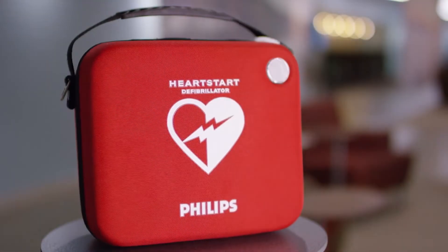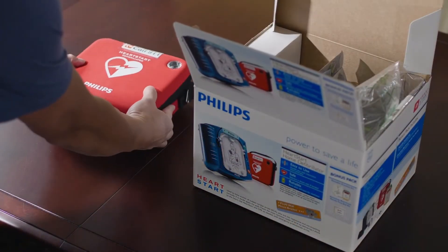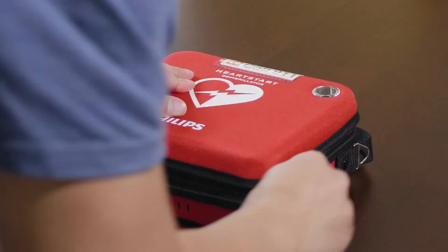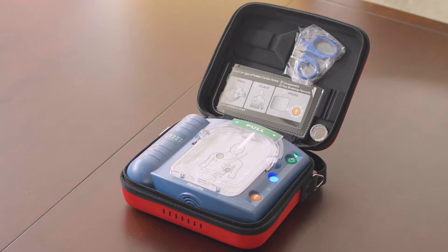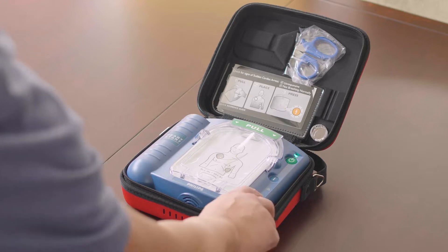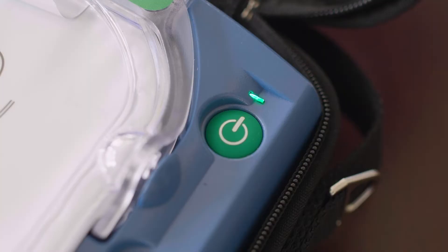To set up the HeartStart Home AED for the first time, first remove it from its packaging, then take it out of the red case and pull out the red tab to start the automatic battery self-test. A voice from the HeartStart Home AED will instruct you to press the flashing orange shock button — no shock will be given during the self-test. After about a minute, the test will conclude, the device will turn off, and the green ready light will start blinking.